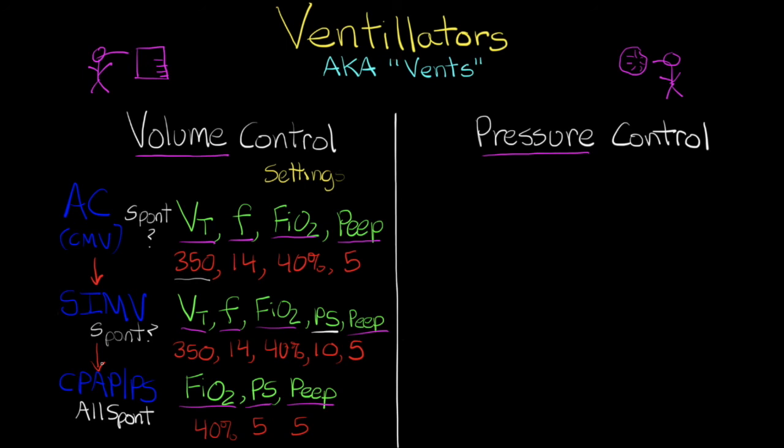And so now this sums up our lesson in talking about volume control and the most common modes of ventilation that you'll see within this category. On our next lesson, we're going to talk about pressure control mode of ventilation.